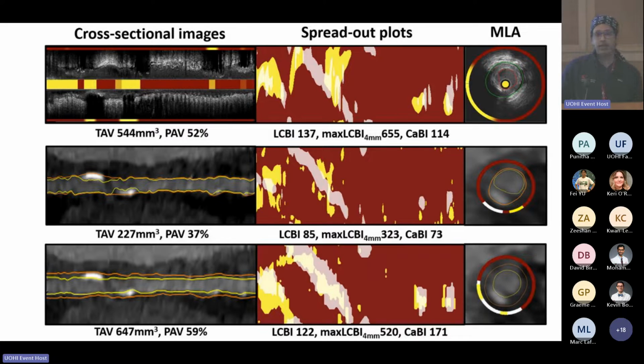It's very exciting. The image quality is remarkably good. It just hasn't, the trials looking at MACE events haven't been published on that, so I didn't get into it. But photon counting absolutely will improve the resolution. Also, the new PET scanners are coming out with much less radiation, so PET inflammation imaging might improve with better resolution and lower radiation.